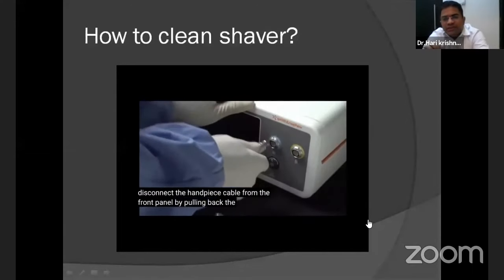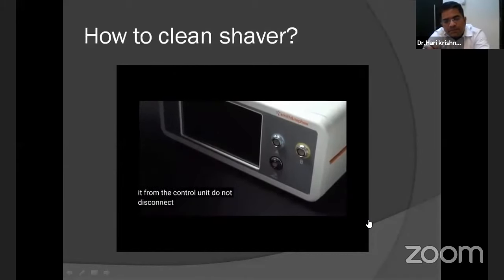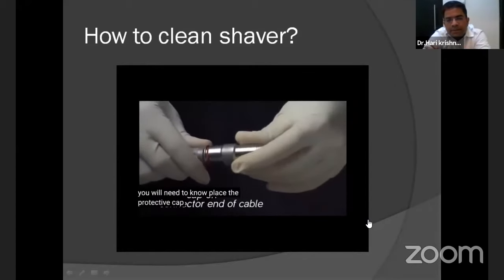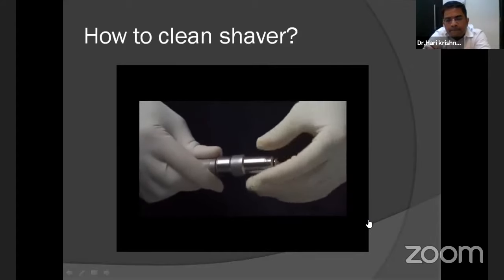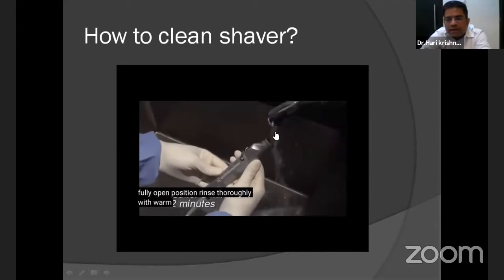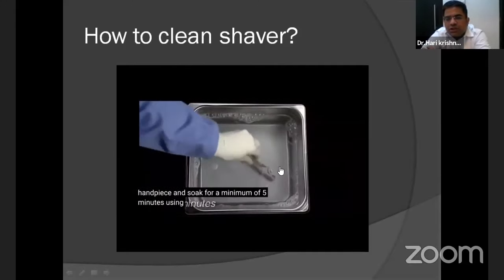So this is the last video, on how to clean the shaver system. Once the shaver is removed from the monitor, close it. The suction has a tip which has inflow and outflow. Keep it under the tap of warm water saline. Once you finish that, keep it inside the soap water solution for 5 minutes.